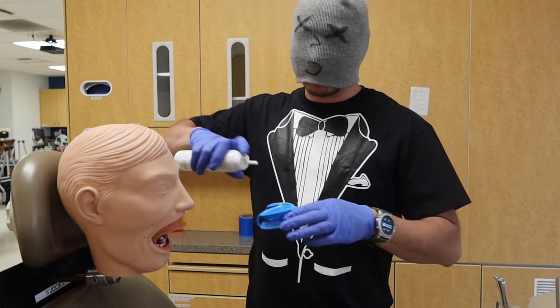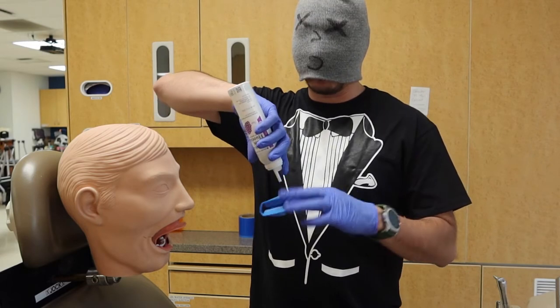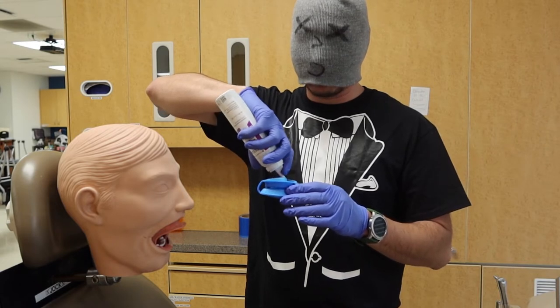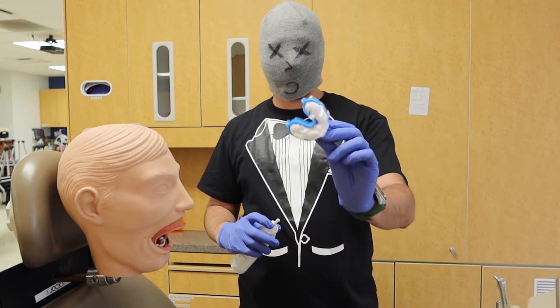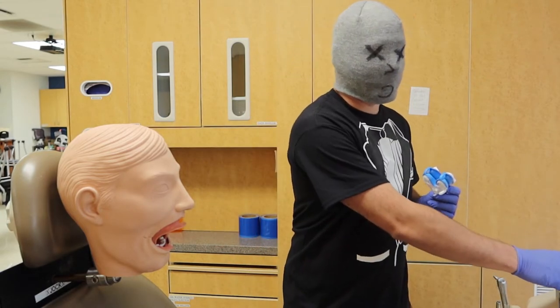Let's go ahead and get this started. We go and get our fluoride foam and give it a little squirt. Make sure to have your fluoride can at its vertical upside-down angle as we go and fill our tray. Now that we've got a good nice fill on the top and the bottom, we can go ahead and get that ready to insert into our patient's mouth.